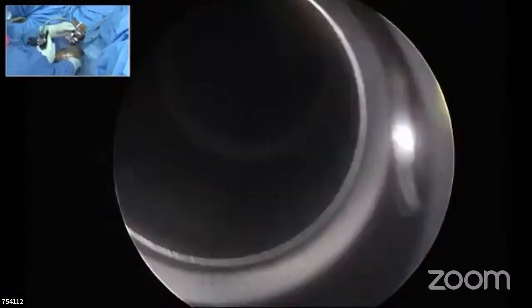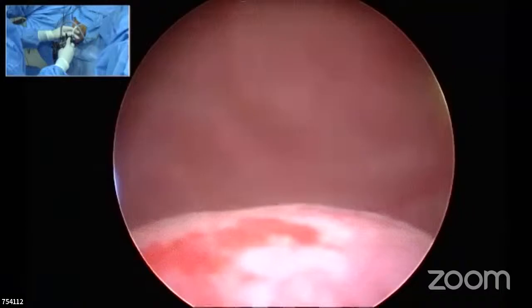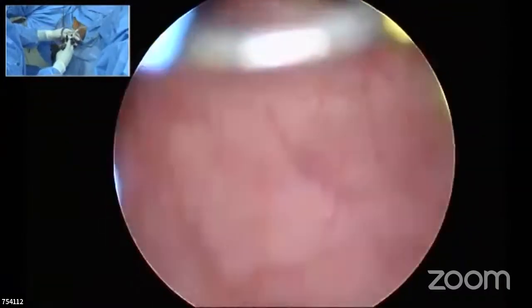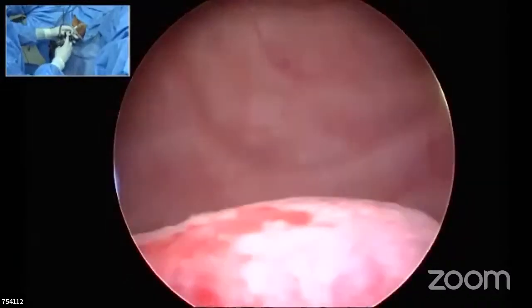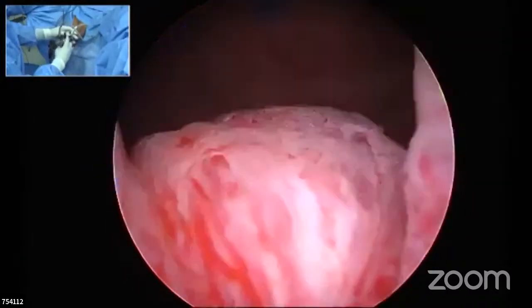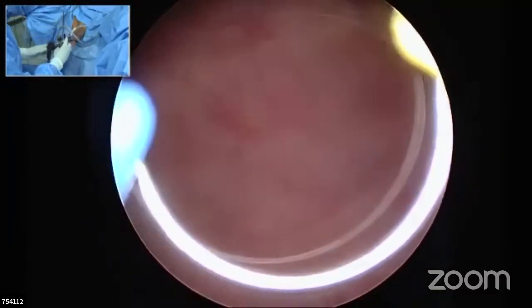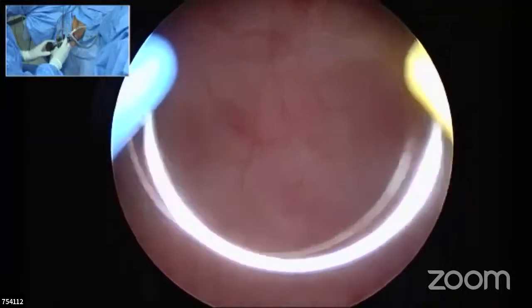Right, sir. I'll start resecting the median lobe. Two issues whenever you start resecting the median lobe. Don't resect the median lobe when the bladder is empty, because the dome can come towards this area and you may injure the dome. So keep the bladder half full whenever you start resecting the median lobe. That's a mandatory thing, which I always advise.